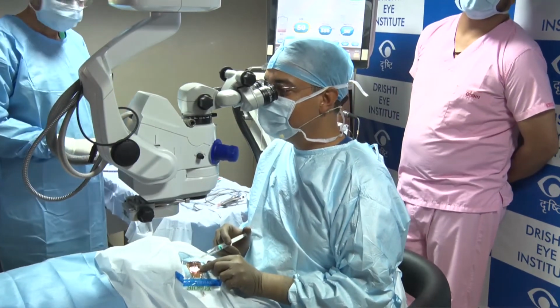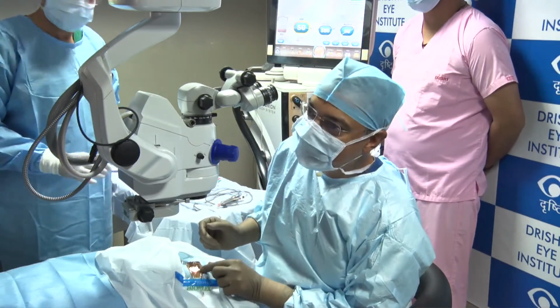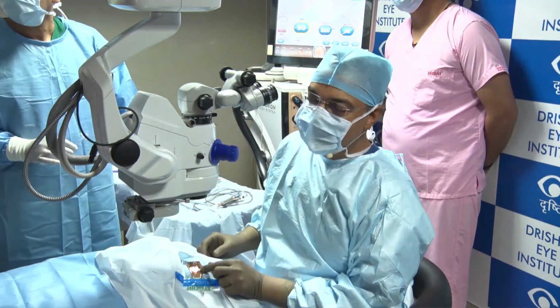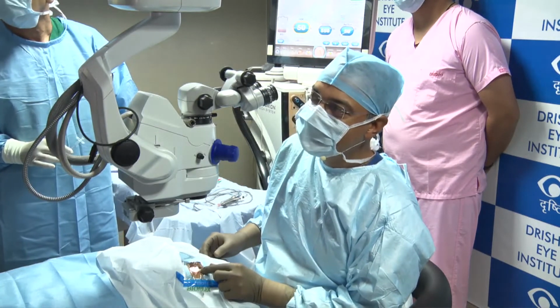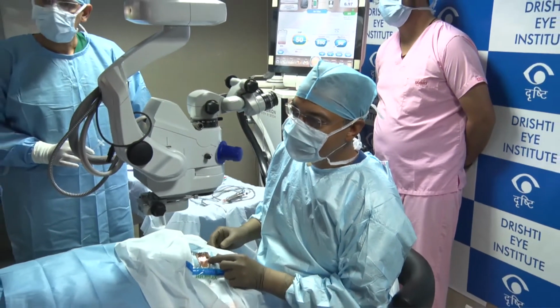The IPCL seems to be well centered now. And we can show the vault. Can we quickly show the vault in a moment in the OCT? That will give everybody an idea of how the thing looks. So if you can show us the vault. If they're trying to show the vault, you'll have to go deeper. We don't want to see the cornea. We want to see the lens and the ICL. And you'll have to improve the gain. The gain has to be improved.